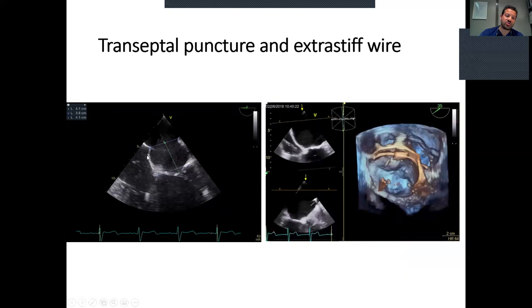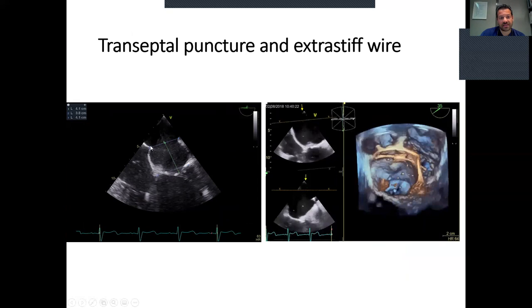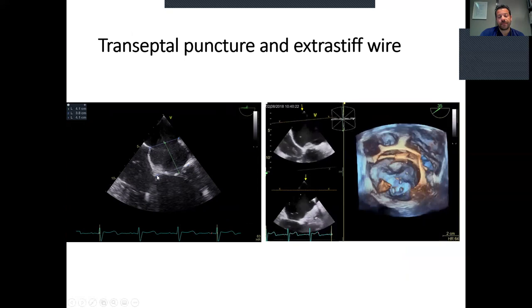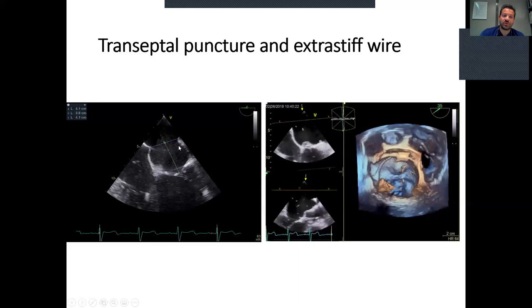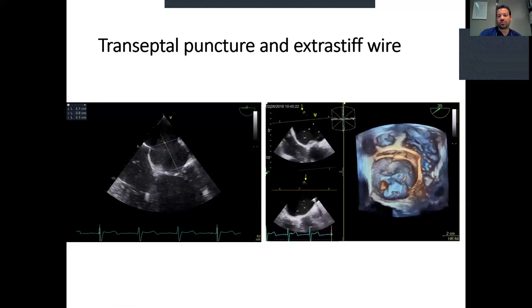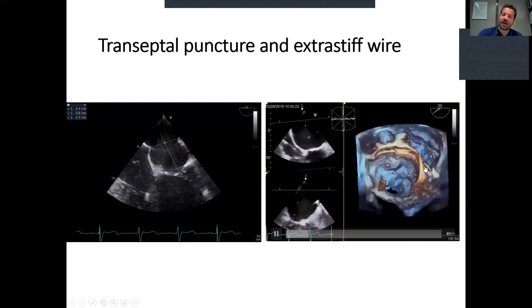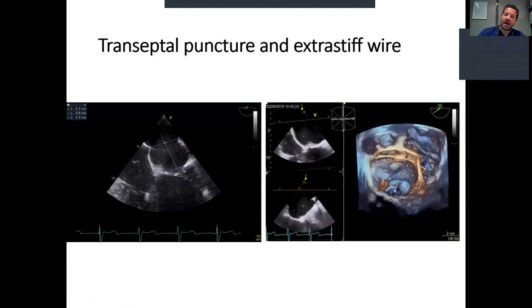Before puncture, we have to measure the height — you can see the tenting of the septum, and from this point we measure the height towards the annulus. We have to be more than four centimeters higher from the annulus. After measuring the height, we proceed with the extra-stiff wire towards the left atrium.